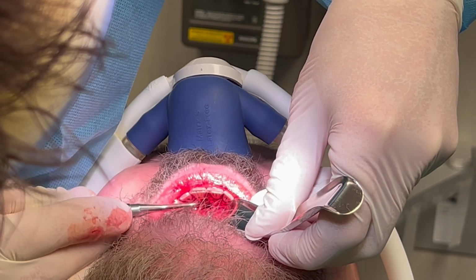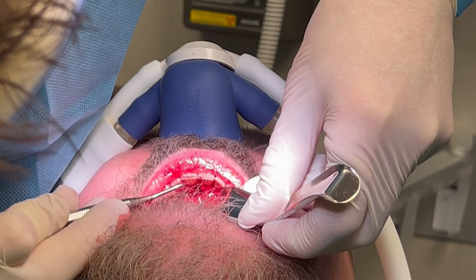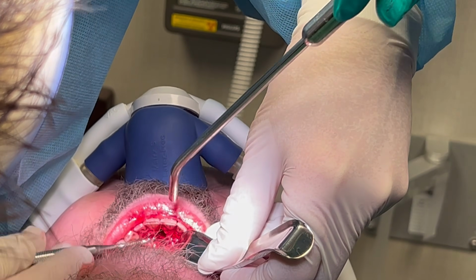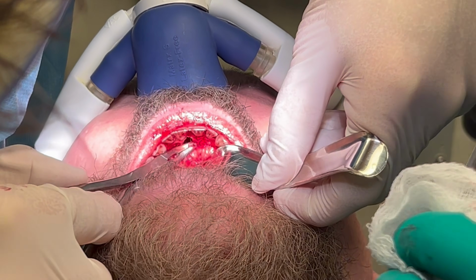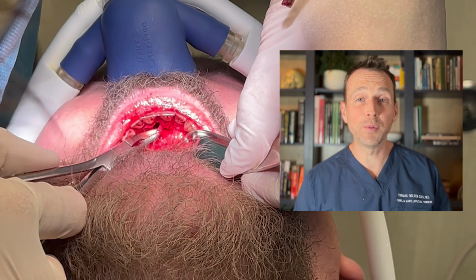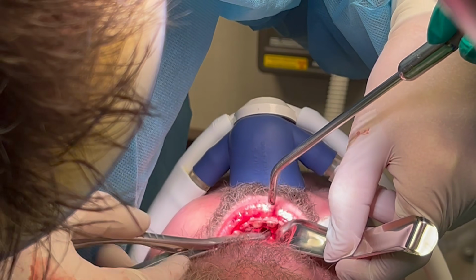This is also where the artery and nerve are located, so it's important to be ready to deal with an arterial bleed if the artery is damaged. This is a very friable lesion. It tears easily and comes out in multiple pieces.